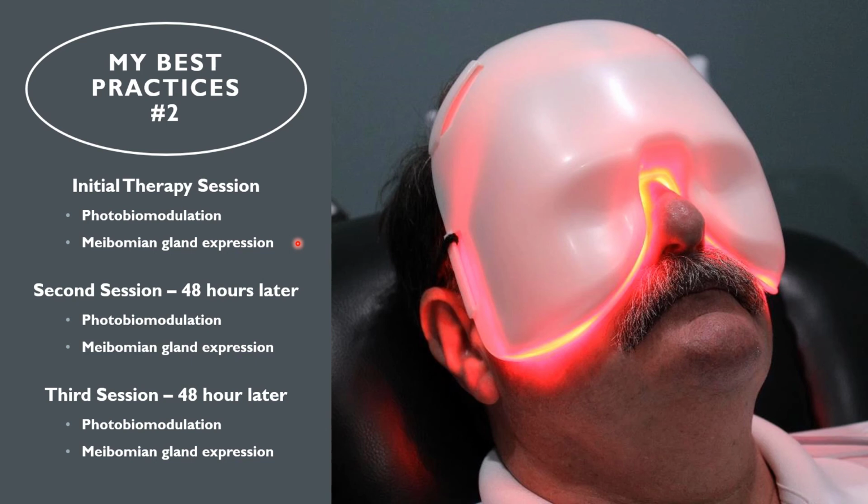The heat is not the primary mechanism of the mask, it's almost just a side effect. There's some heat generated from the light, and it produces a warm feeling. I mean, it's there. You can tell you've got something on your head. So it actually is hot enough to soften the meibum and to facilitate the expression of the meibum immediately after the treatment. I've got two articles that clearly say, you can't wait for it to cool down. You've got to do it within 5 minutes. You immediately express the glands, and then you come back 2 days later, and you do it again. And then you come back 2 days after that, and you do it again.